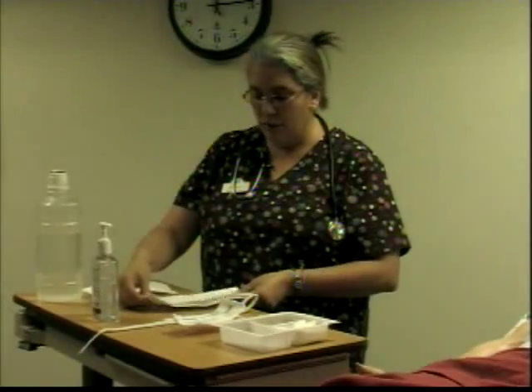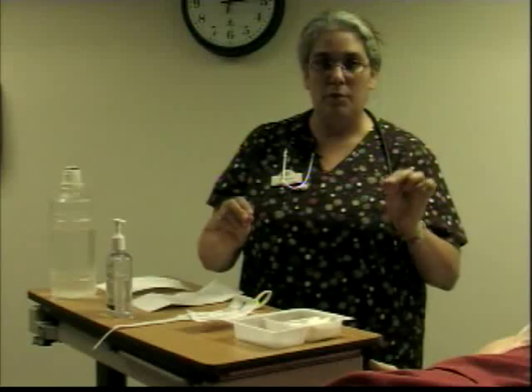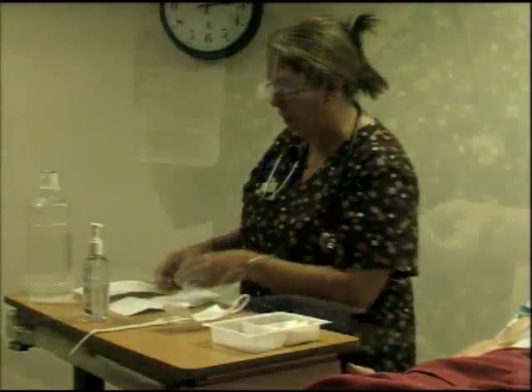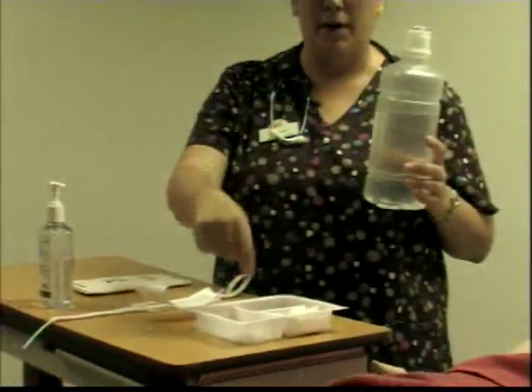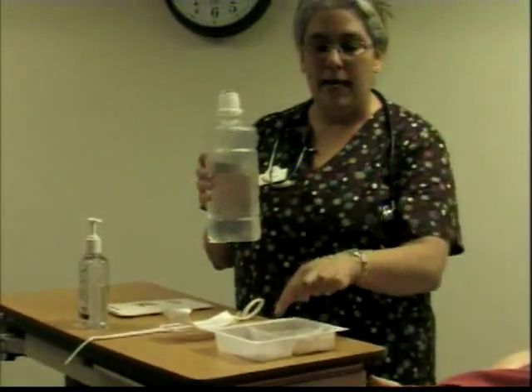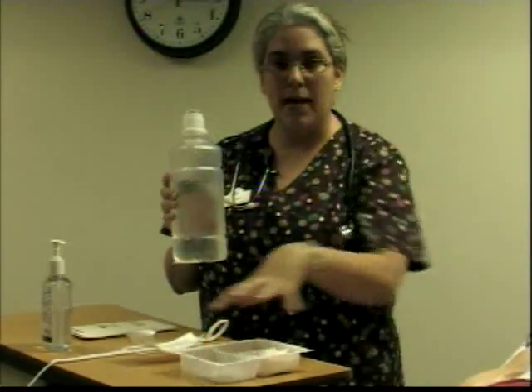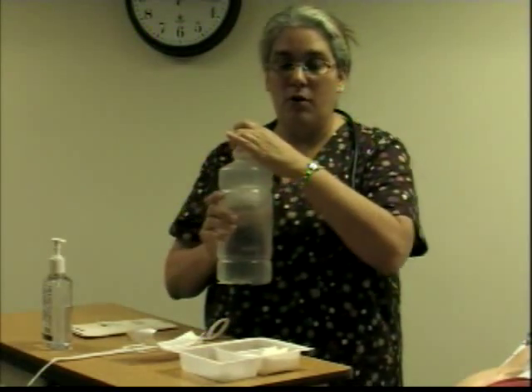So when it comes to sterility, the major item that you want to make sure that you maintain sterile is your inner cannula. This is what goes inside the patient's trach. So you want to make sure that you handle it in such a way that it's not going to get contaminated. Okay, and I will show you that when I reach over and grab the brush in the packet. I only did that for demonstration purposes. I wanted to show you what it looked like, but of course, once this packet is open, you don't want to reach in there with your bare hands. You want to make sure that you have your gloves on.